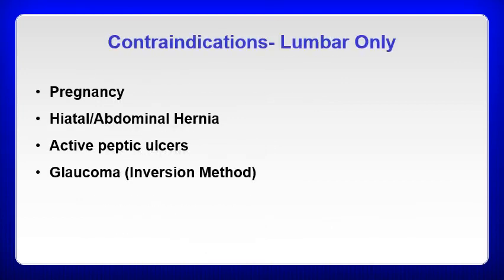Now, these are specific for lumbar only. So pregnancy, hiatal or abdominal hernia, active peptic ulcers, and glaucoma for the inversion method. So you don't want somebody with a glaucoma doing inversion treatment.